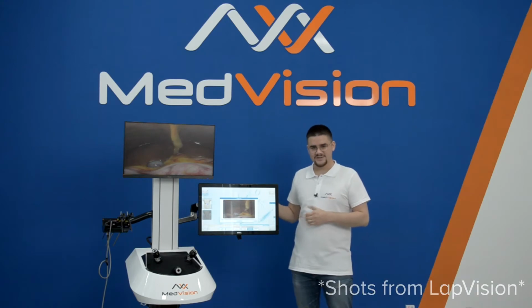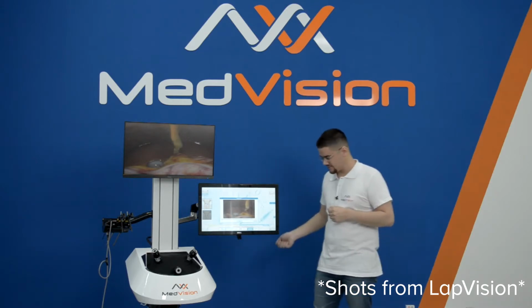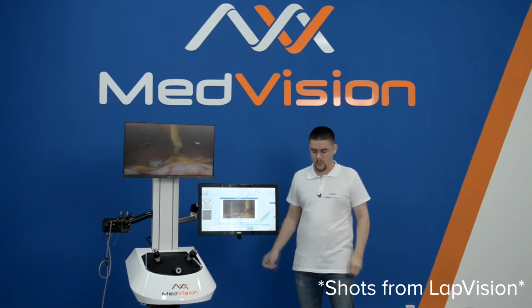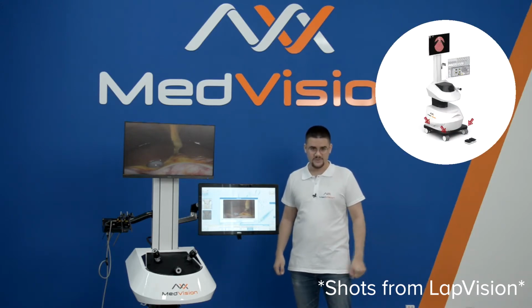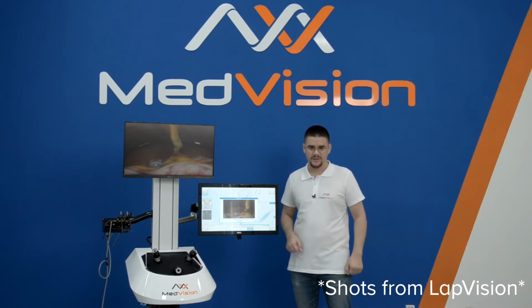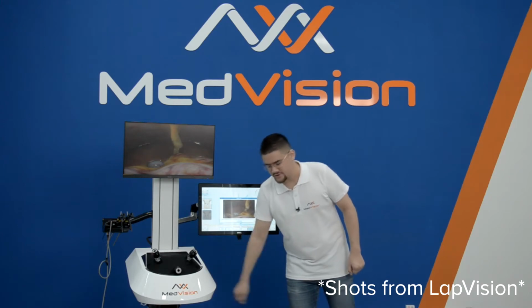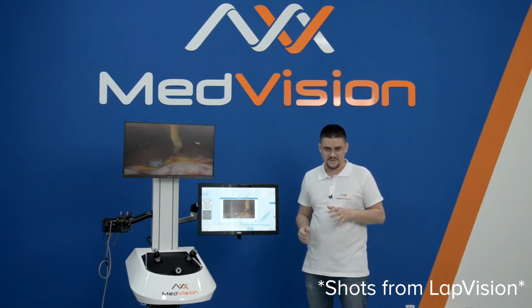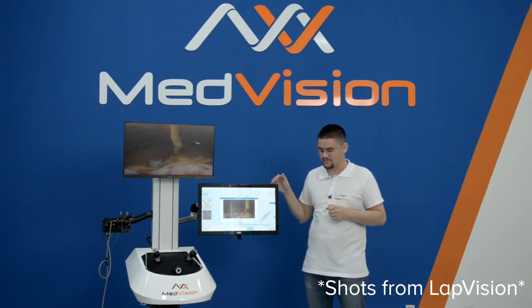The standard version is an all-in-one system, which makes it very convenient to deploy. It's a plug-and-play system. All you have to do is plug it into the outlet and you're good to go. So let's start going through the features of the simulator. At the bottom we have 4 wheels with stoppers to fix the simulator in place. And on the right-hand side here we have the on and off switch. All you have to do when you're launching a simulator is do a short press, and the software will launch automatically. No additional actions are required.